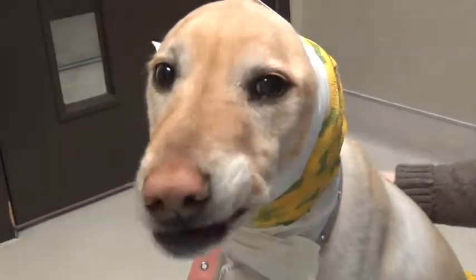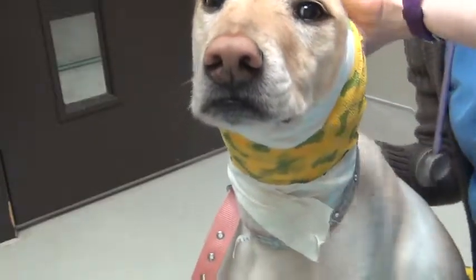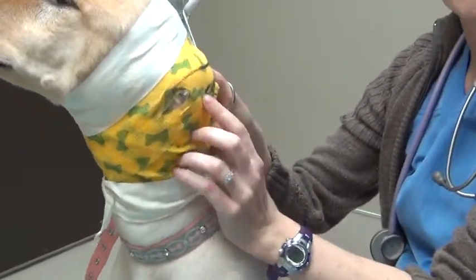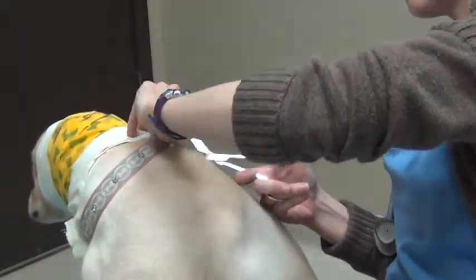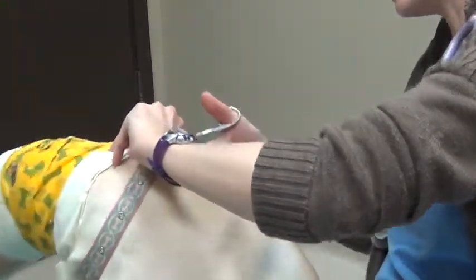They like shaking it. Okay, so what I'm going to do to remove it is I'm going to really avoid where the ear is taped up onto the head. And in order to do that, I'm going to utilize the diagram that I have up here of the ear. And also I can use the other ear as a vantage point of where to go. So I'm actually going to start from the bottom, make sure I have all the bandage layers isolated in my hand, and use some bandage scissors to take that off.